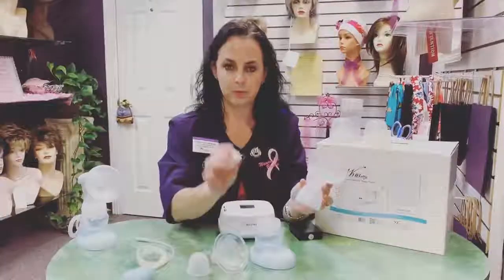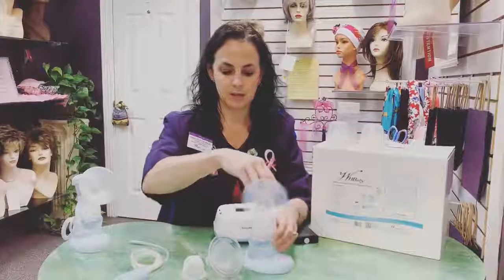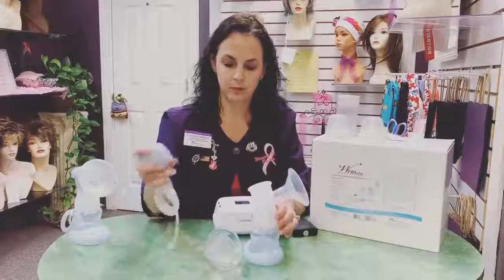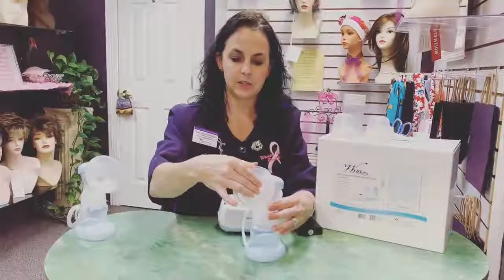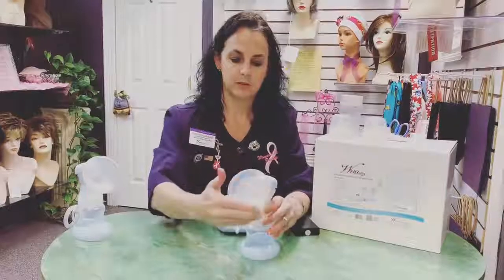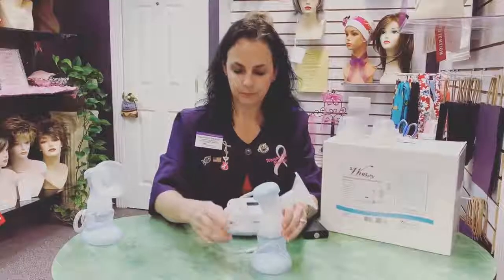You'll want to reassemble. You'll just replace your valve membrane piece. You'll set it back onto your bottle. Gently replace your diaphragm. Replace your cap. Insert your flange cover if you're using the 24mm. And gently put it back on there, and you're ready to go.